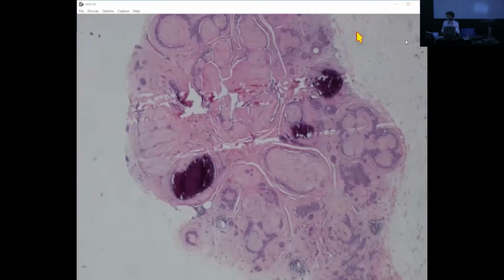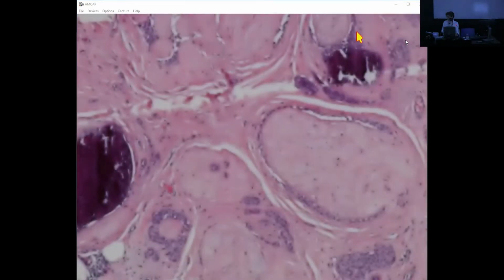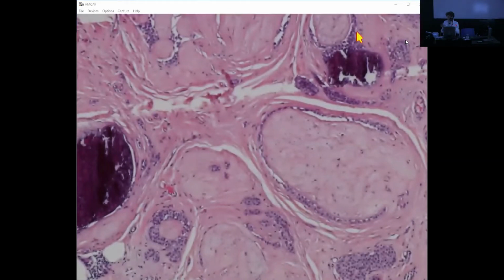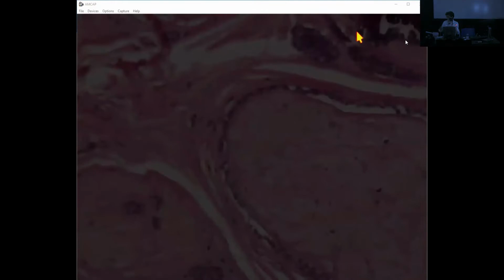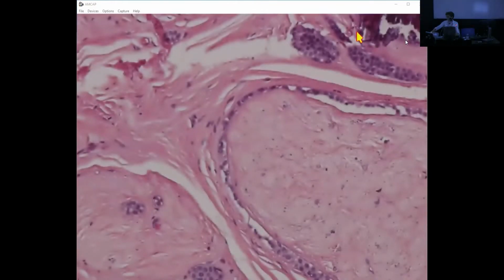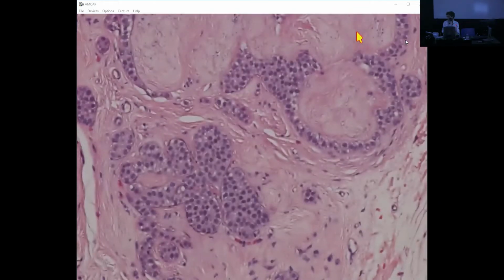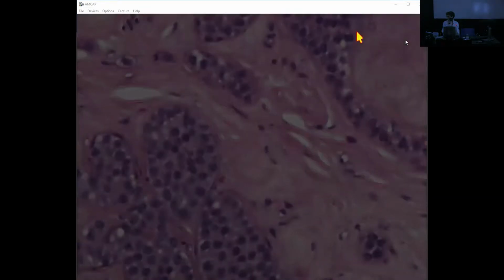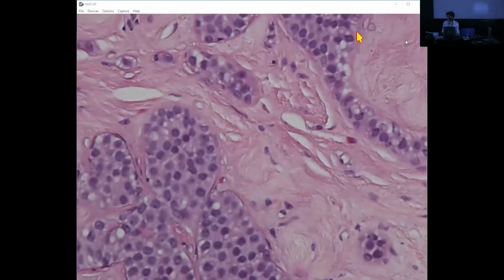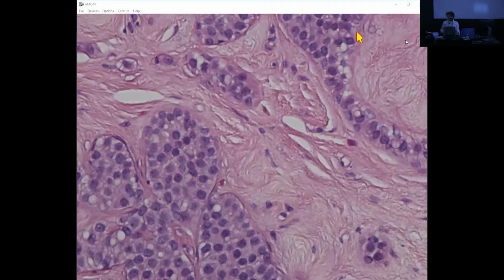Here is a focus. Normally in fibroadenoma, especially in the sclerotic ones, we find just a layer of residual ductal cells, but here there is a little bit of expansion. So again, an example of atypical lobular hyperplasia, probably I would call this. It's not very extensive.